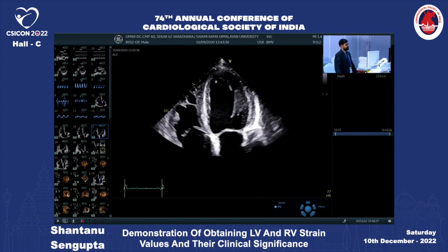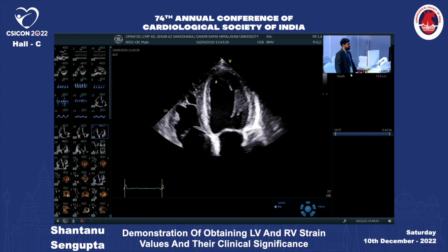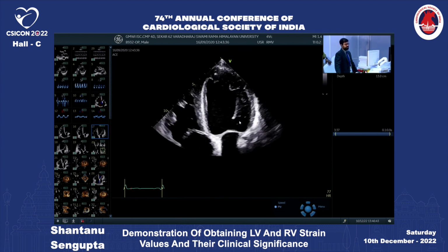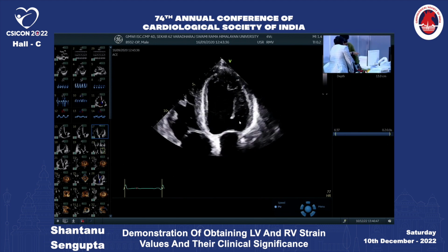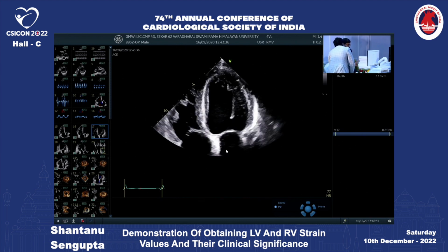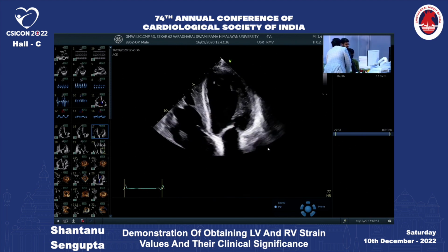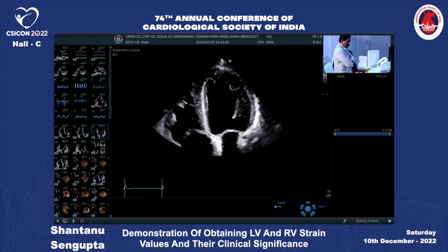Every machine has something called frames per second. I'm just explaining, sir. The thing is, you cannot acquire on these frame rates. We need 50 to 70.